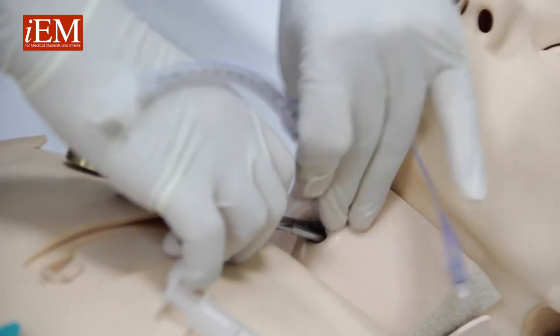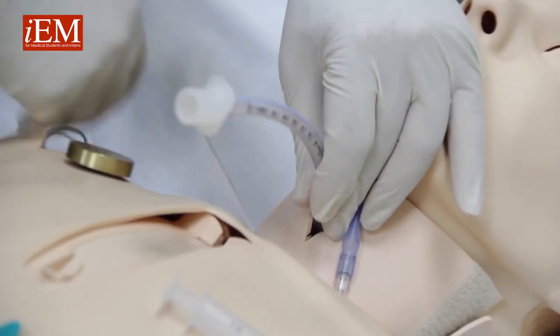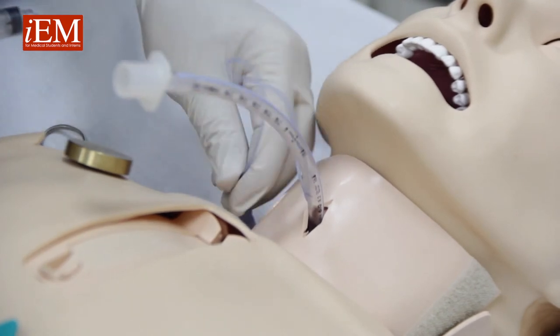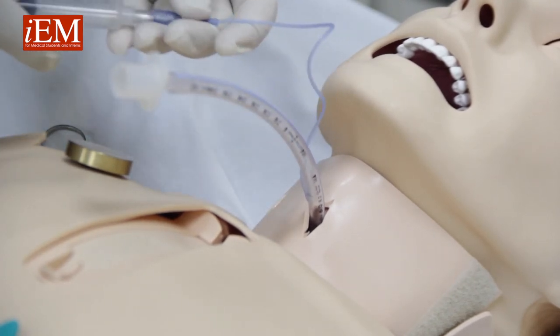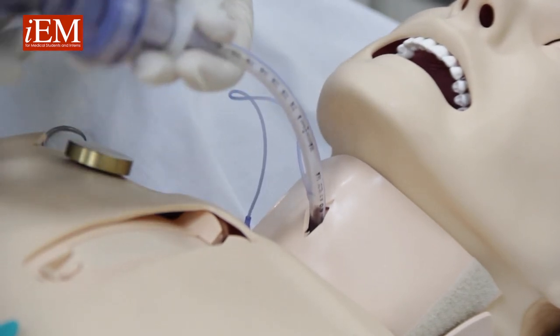between the Kelly. Take your Kelly out. Inflate the balloon. And you can now bag.